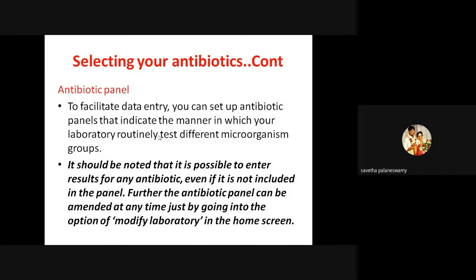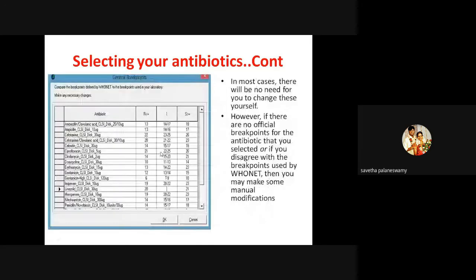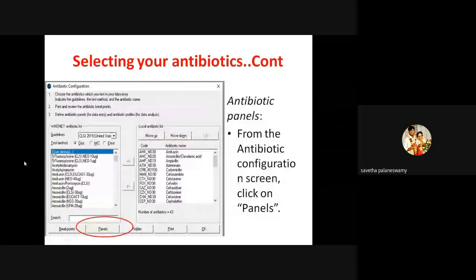Next, what is this antibiotic panel? So next we come to this panel. Actually, different laboratories have different panels. They have their own panels also. So based upon that, we can create our own panels. So how to do that? Just click on this panel.